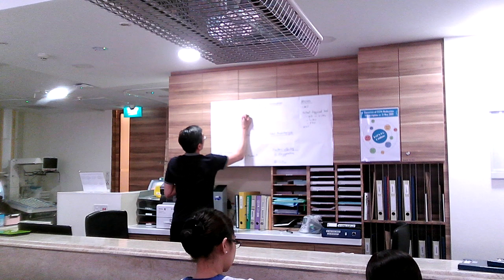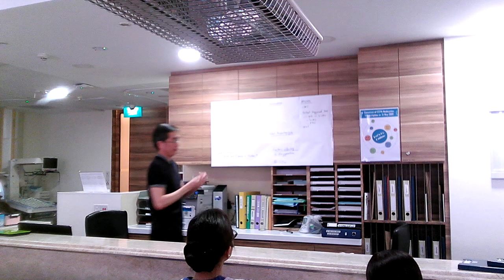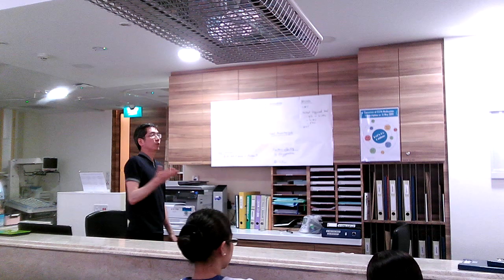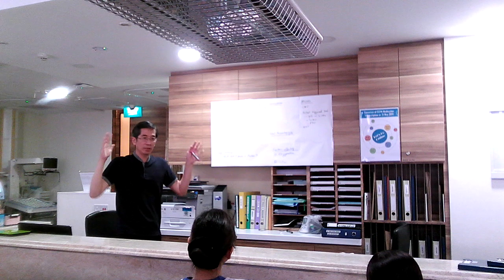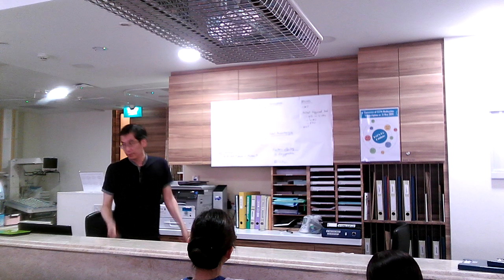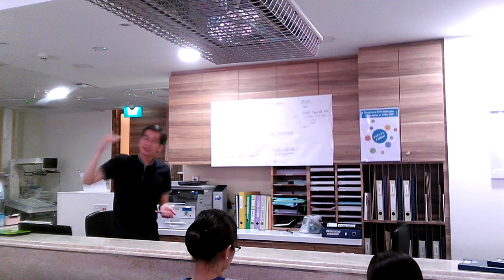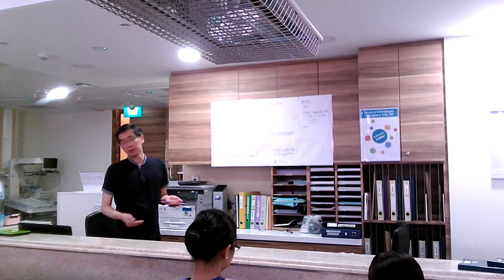And once you're controlling it in such a way that a certain amount of volume or pressure is being used, then you must have a point where you say, okay, we are ending the breath. The breath can't go on forever, so there must be a way to cycle off the breath.